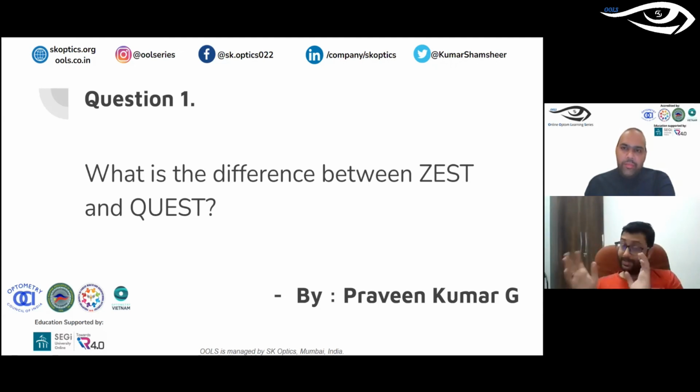So the instructions always matter, and usually what we say is to give instructions which are not too liberal and not too conservative, and follow the same set of instructions for everything. If you really want to look at it, have a look at the ocular hypertension trials or the Canadian glaucoma studies, the glaucoma intervention studies, the CIGTS studies. You can look at how the instructions are given. They have already printed out those instructions there. So please follow that particular instruction so that it is the same for all patients.